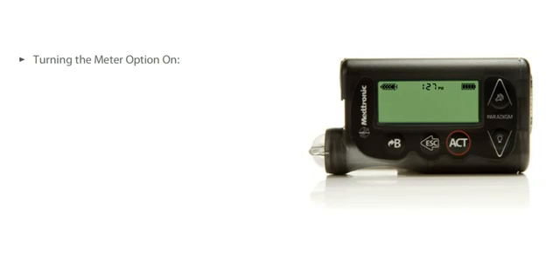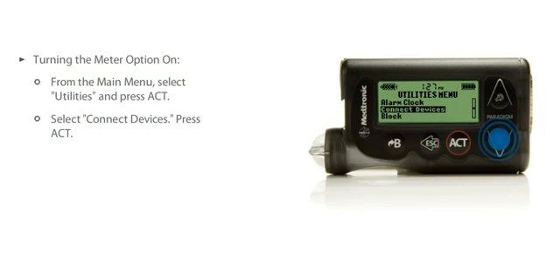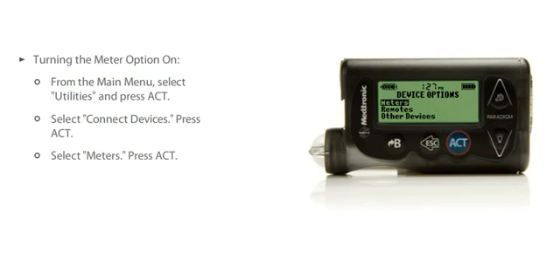To do this, select Utilities on the main menu and press Act. Select Connect Devices and press Act. Select Meters and press Act again. Now, select On and press Act.